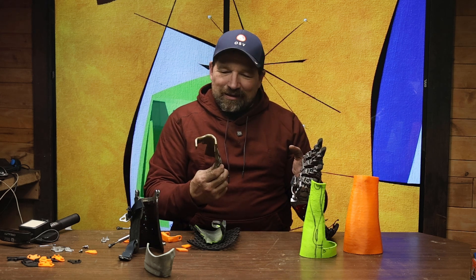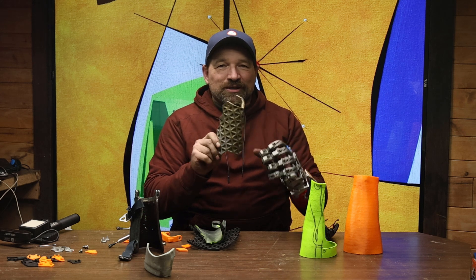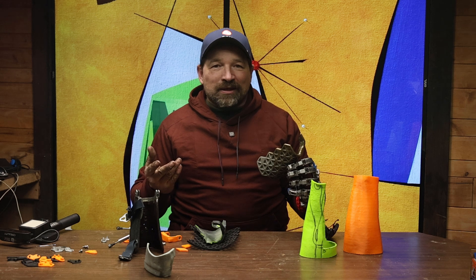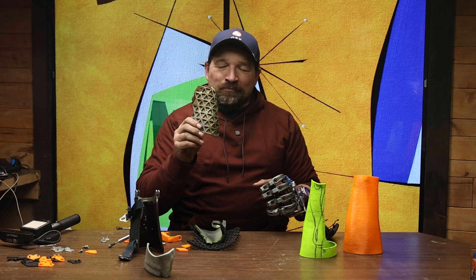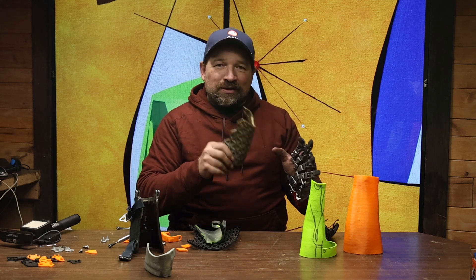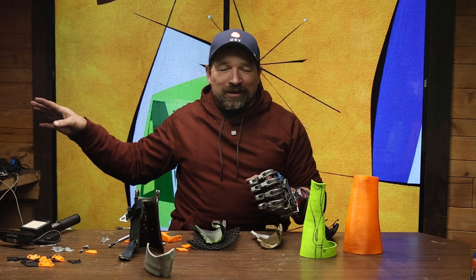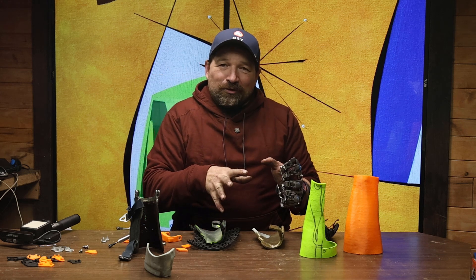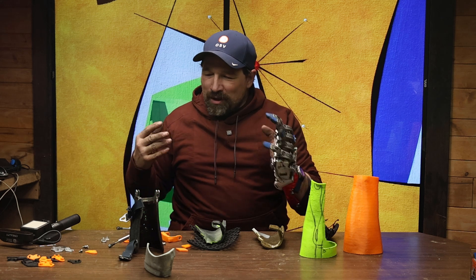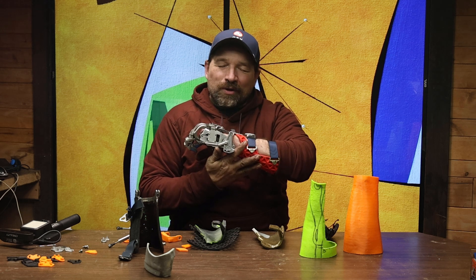The neat thing about it is I really haven't done any digital generation of this aside from a little bit of cleaning up in Meshmixer and using the scanner. I've been going back and forth between physical to scan to print to physical, rather than generating everything in the CAD environment. I've been doing just the opposite — starting with physical and then going to CAD — and it's kind of a neat experiment. I think it's going to work out really well.